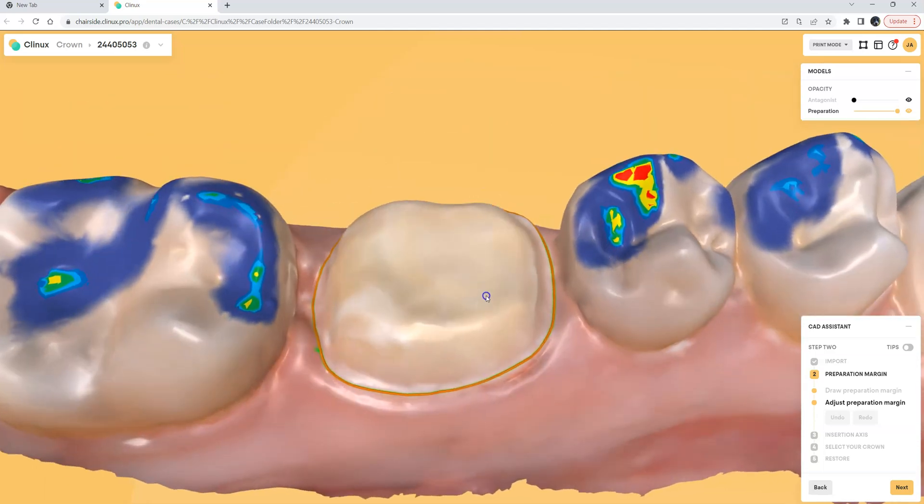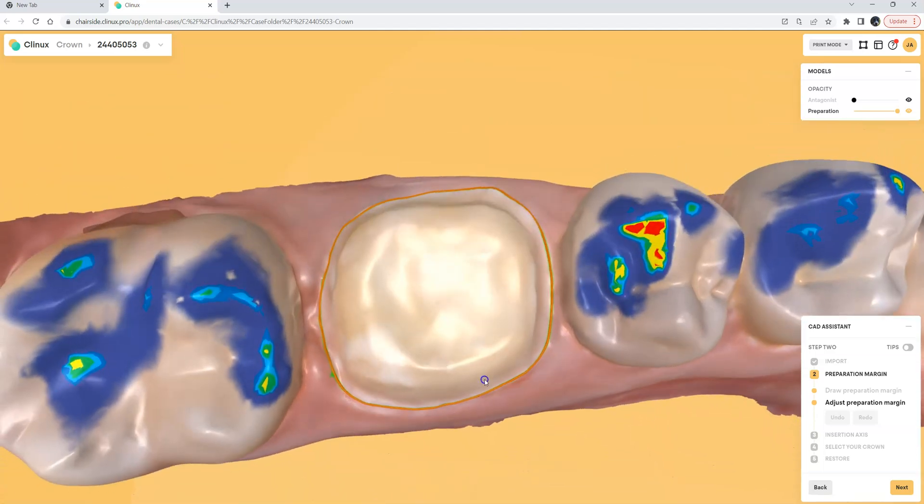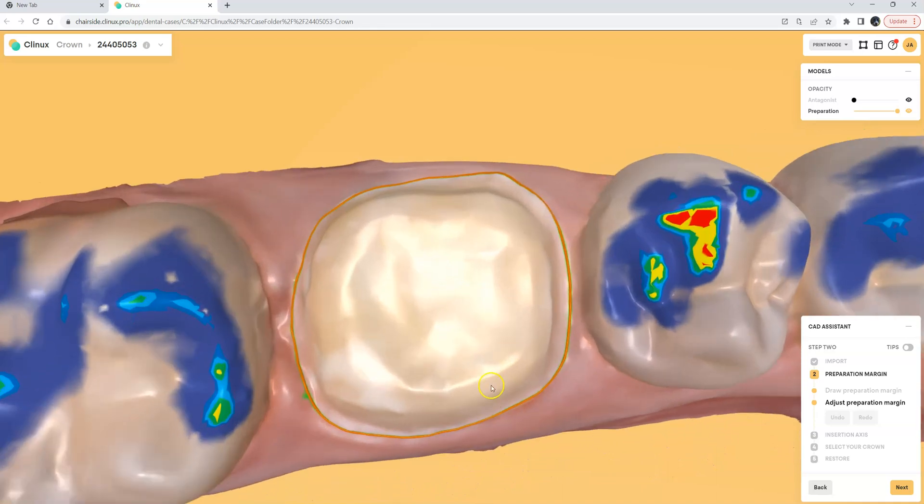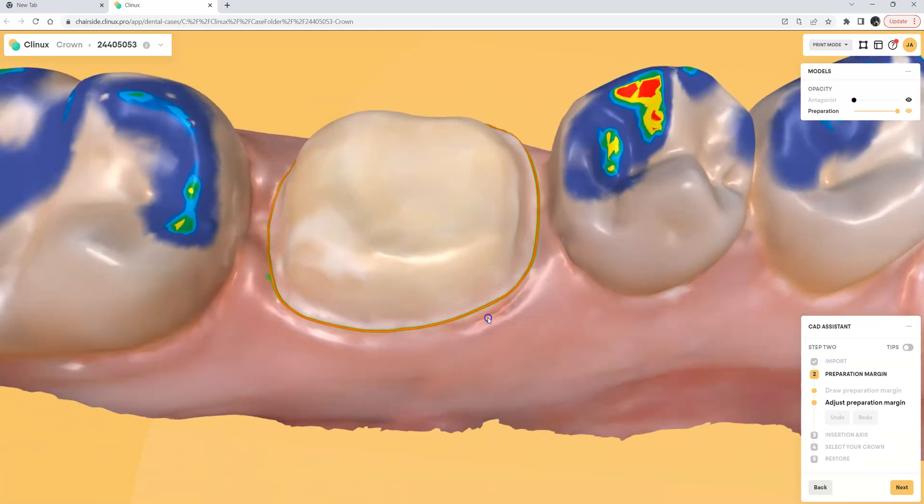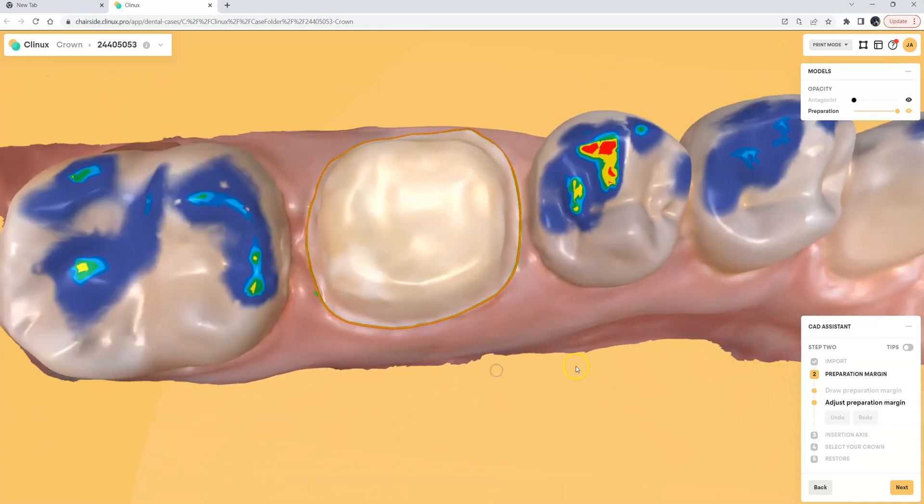If you want to draw the margin inside of Clinics you can skip the margin step in MeditLink and of course you can edit the margin here inside of Clinics once it's done.